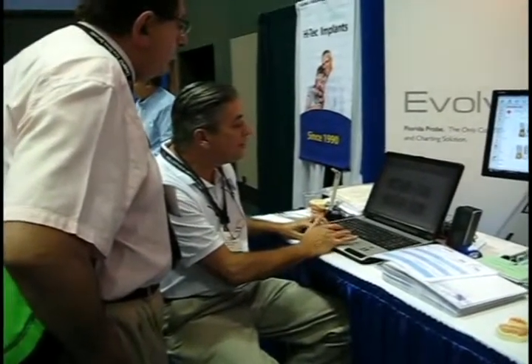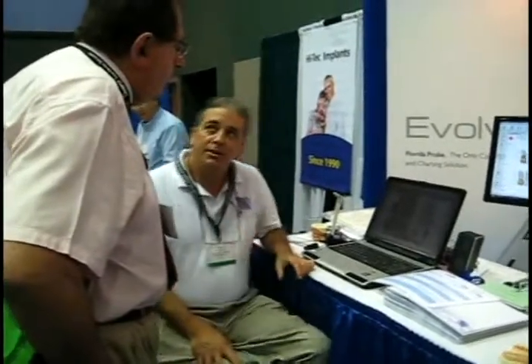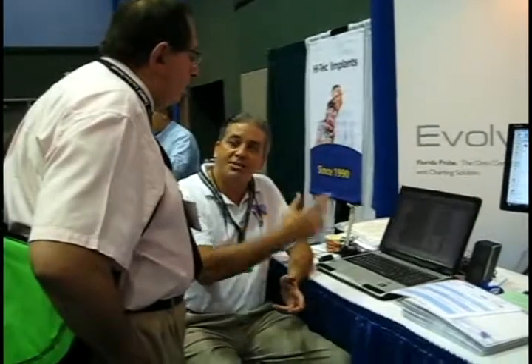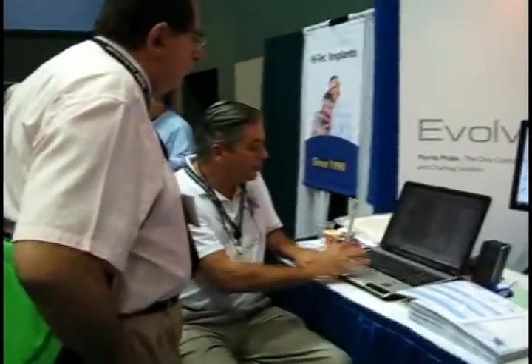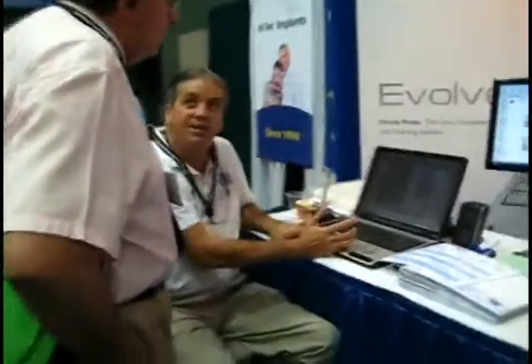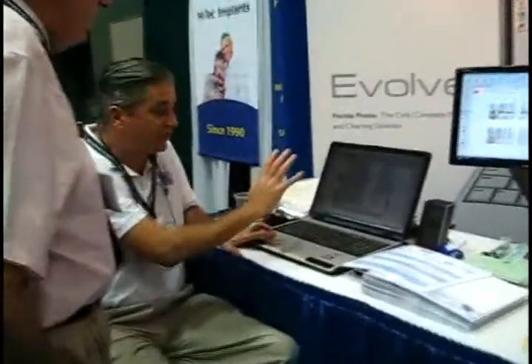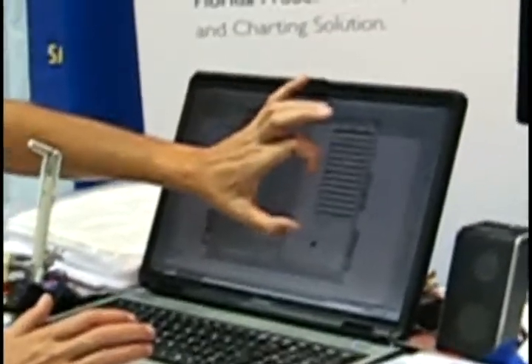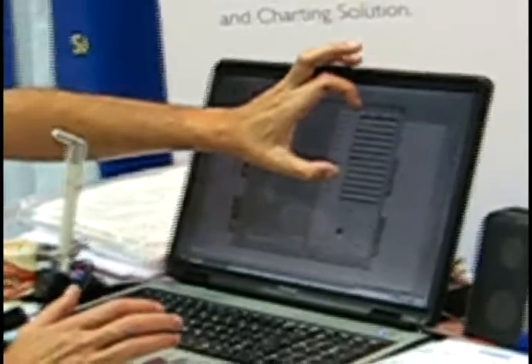We also include a periodontal risk assessment. Based on systemic health, smoking habits, oral hygiene, patient's age and genetics, we're building a graph of risk specific to that patient. This is unique in that not only are we looking at the risk factors, but we're actually using the probing data to modify the risk.